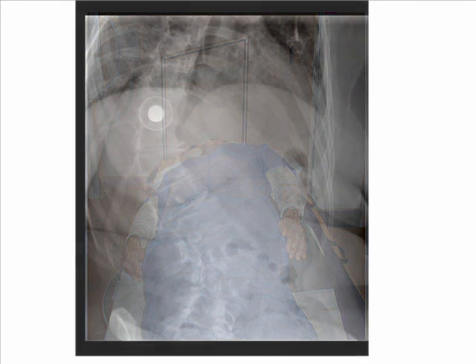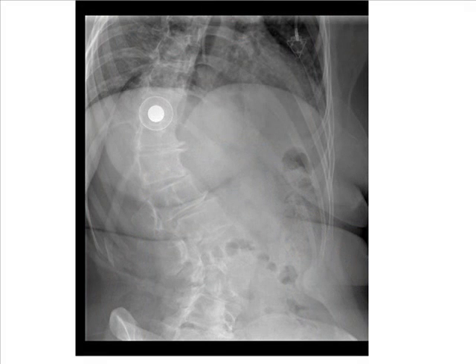Center the image receptor top 1.5 inches above the relaxed shoulder and the lower edge of the image receptor at the level of the iliac crest to image the ribs below the diaphragm. The central ray is between the lateral margin of the ribs and spine, 3 to 4 inches below the jugular notch, or T7, for above the diaphragm, and midway between the xiphoid and lower rib cage for below the diaphragm.